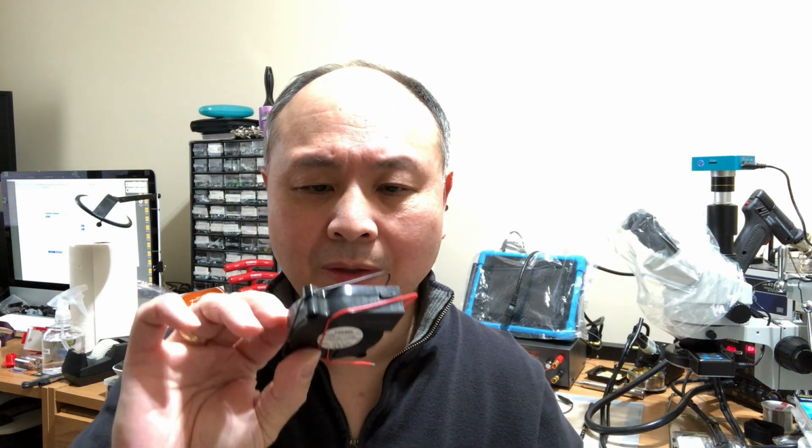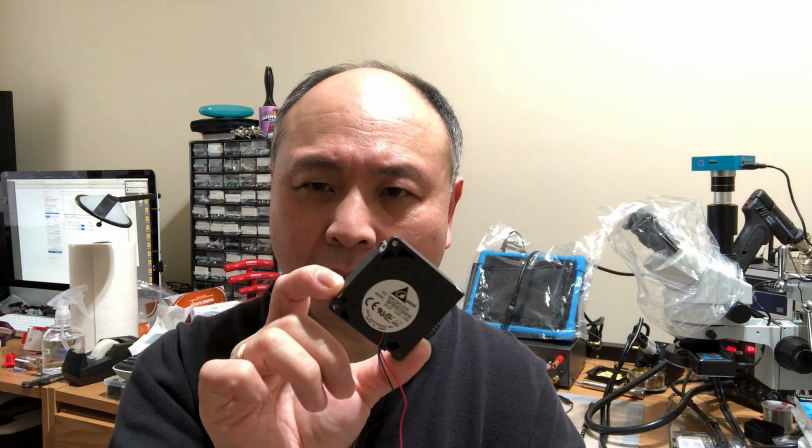The availability of fans, especially in this 51 millimeter round rectangular format fan, which I originally specified, is getting hard to find. And so it was important to allow other types of fans to be used as long as they have the proper static pressure and flow characteristics. And I did find a 50 millimeter square blower fan. It's in the main project link, but this does not fit the original STL for the fan mount, and that's why the fan mount has been modified.